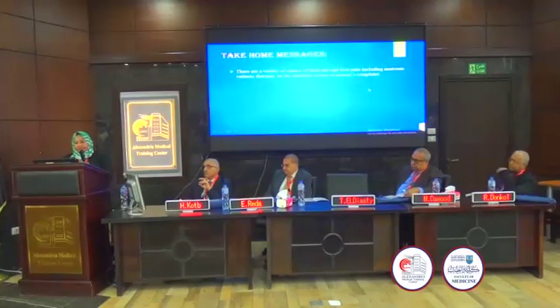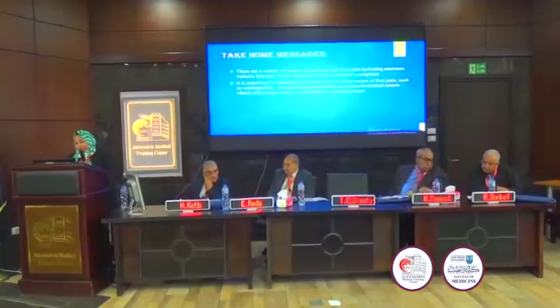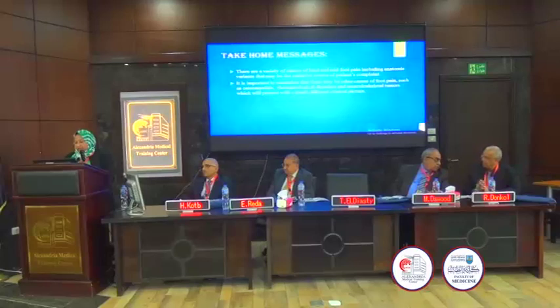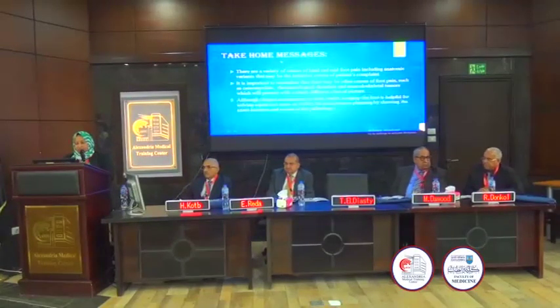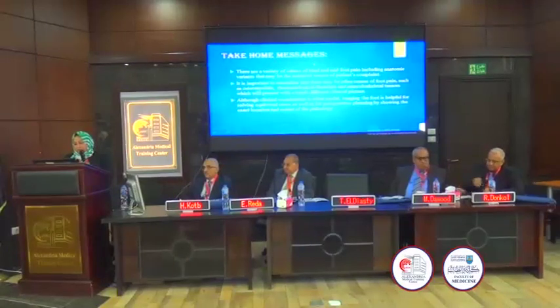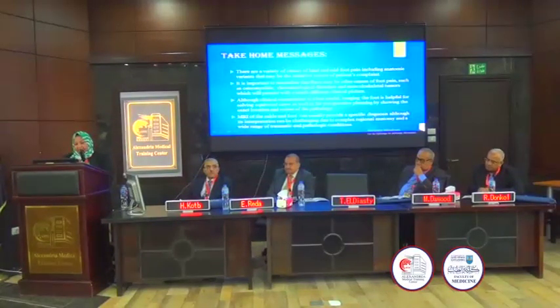The take-home message is that there are a variety of causes of hind and midfoot pain, including anatomic variants that may be the initial source of the patient's complaint. It's important to remember that there may be other causes of foot pain beyond the scope of these lectures, such as osteomyelitis, rheumatological disorders, and musculoskeletal tumors, which present a much different clinical picture. Clinical examination is also often useful. Imaging the foot is helpful to solve equivocal cases and for pre-operative planning by showing the exact location and extent of the pathology. MRI of the ankle and foot can usually provide a specific diagnosis, although its interpretation can be challenging due to complex regional anatomy and a wide range of traumatic and pathologic conditions.